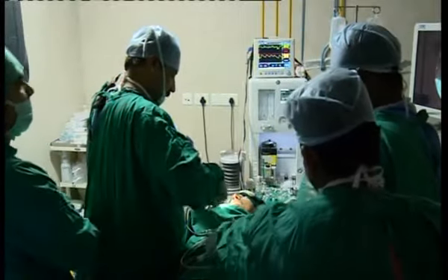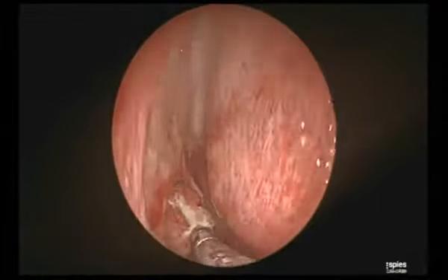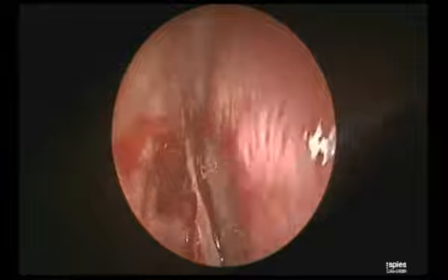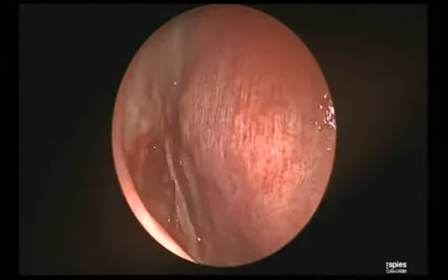So this is about the frontal sinus. Now the next thing, again I will show the removal of the bulla and the relationship to the other structures.